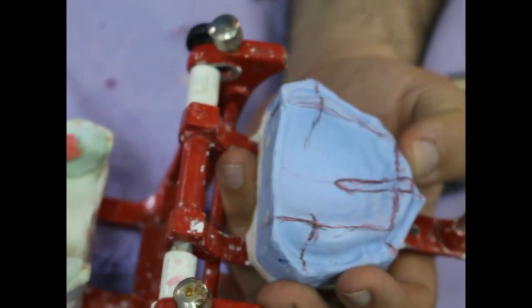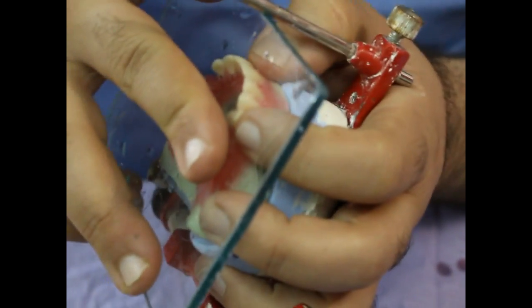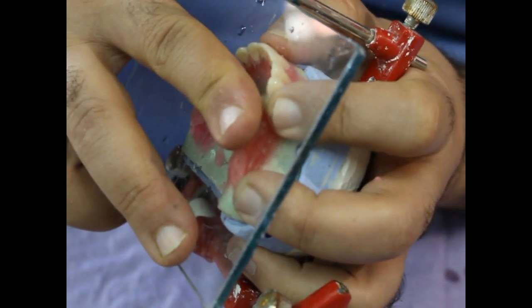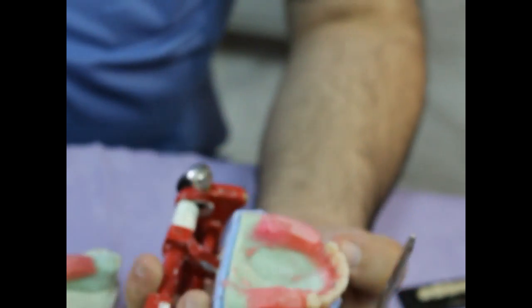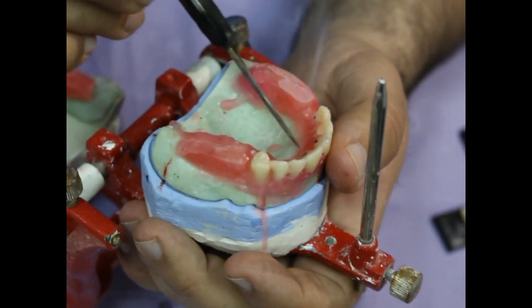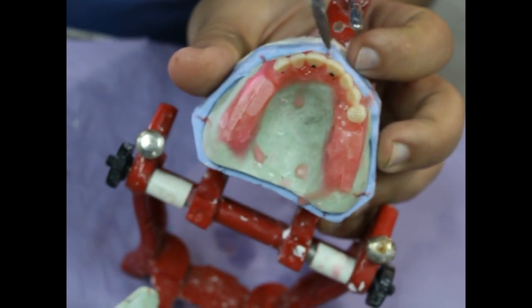Use a hot wax knife to seal the artificial tooth properly. Put the occlusion block in water. Return it to the cast. Make sure that your contacts are proper. You may find at this stage that some of the anterior teeth do not touch the occlusal plane properly. Try to correct them. Corrections should be made individually.